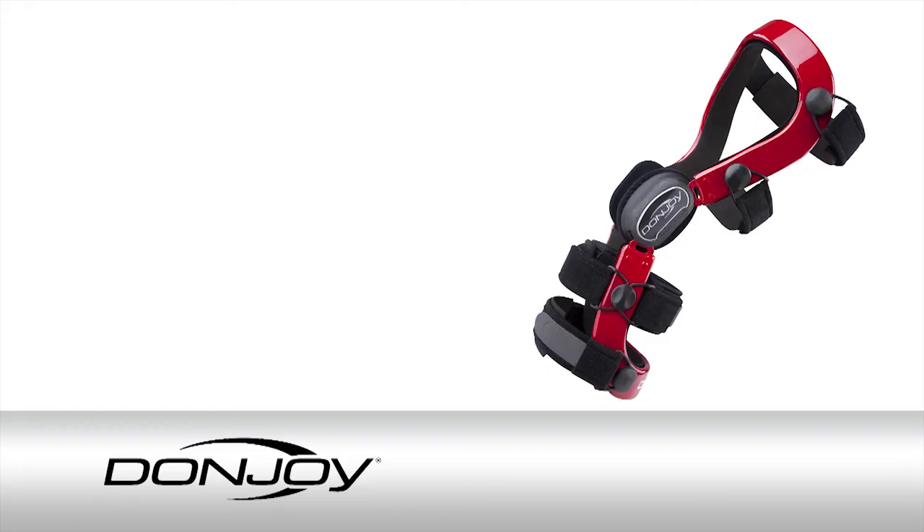To find your size, match these measurements with the corresponding DonJoy knee brace size in the chart. Our knowledgeable brace coaches are trained to help you find the right brace for your needs.